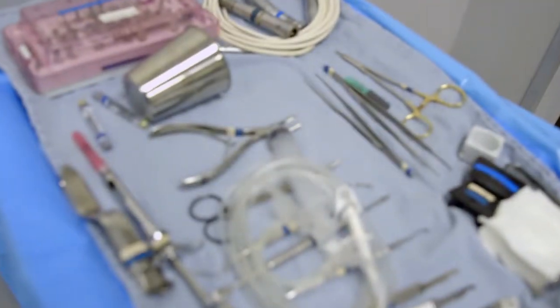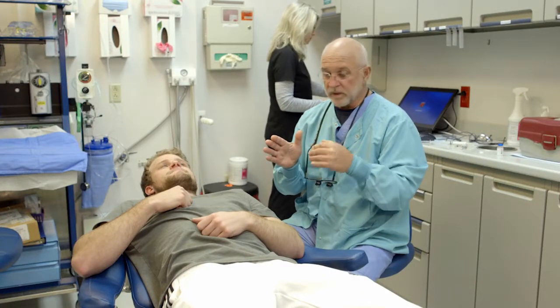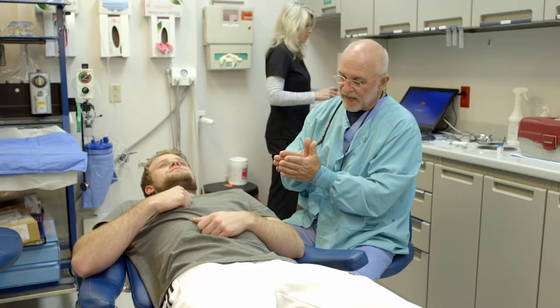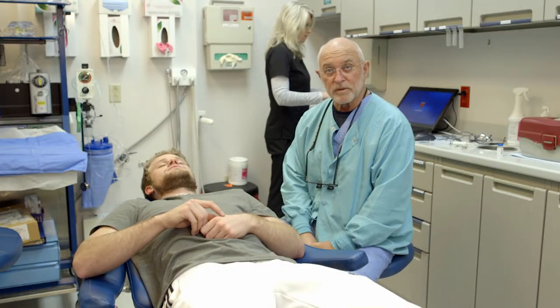So today we're going to do sort of a conservative bone widening technique. His ridge is wide enough that it can be split, and some bone graft material can be added like a sandwich and make the sandwich 150% wider. That'll heal in four or five months, and it'll be better suited to place two implants.